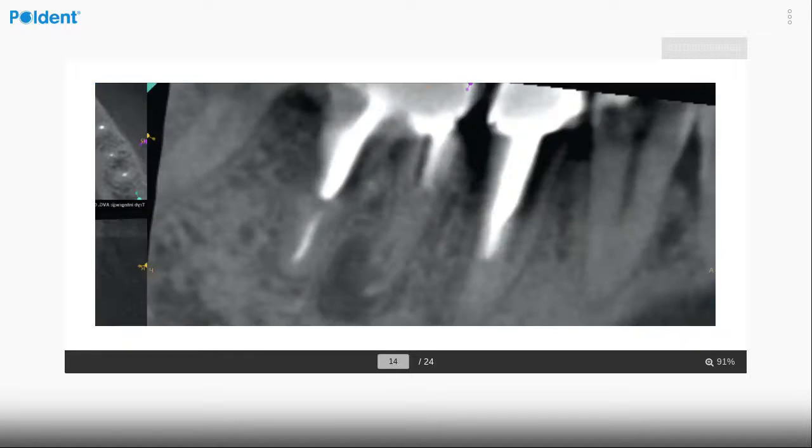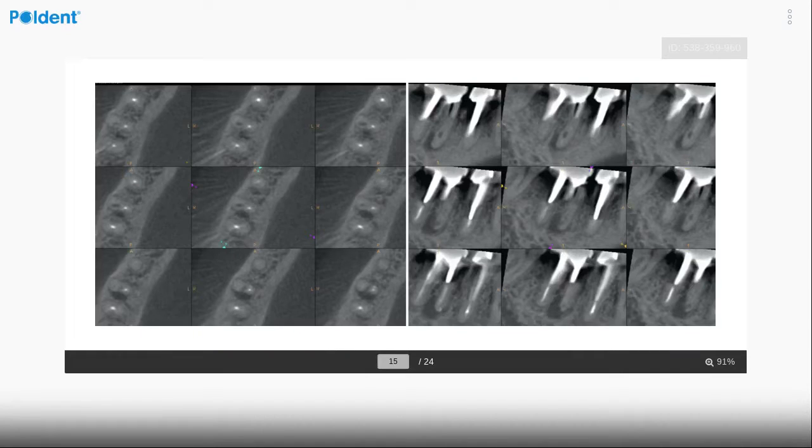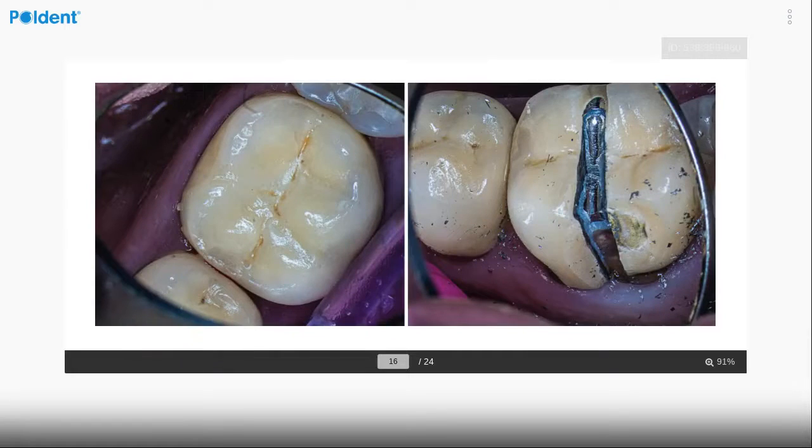And now I want to share a case with you. This is a retreatment case with a post removal, but it isn't the most important. It doesn't make too big a difference, because the idea, as Mark mentioned, is the same: to improve. And we have a tooth with quite a big lesion. We have internal and external resorption of the mesial root, so the inflammation is quite big. So let me go with you through the case.